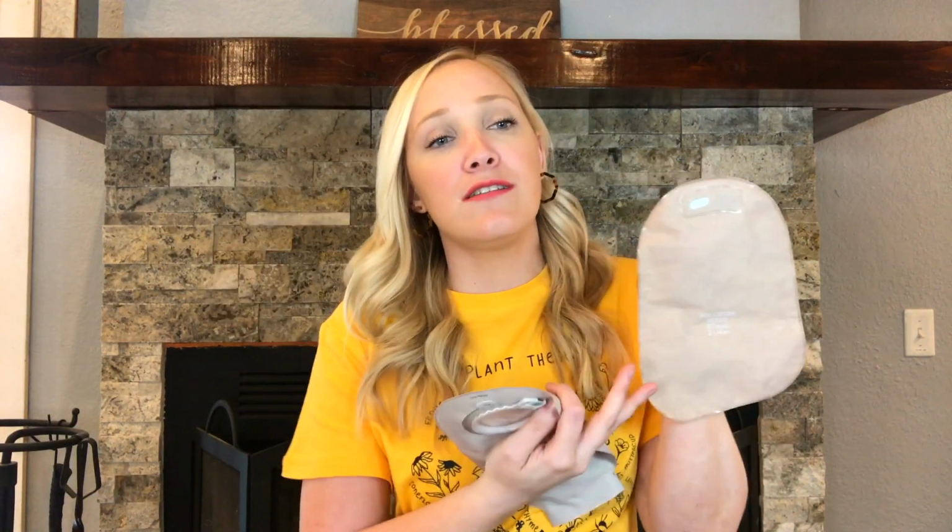This is what works for me. Different things work for different people. This is not the only way, but I hope that this video helped you guys. I hope it helped you at least understand the difference in the 2 types here that I'm showing you, the drainable versus the closed-in pouch, because I had no clue.